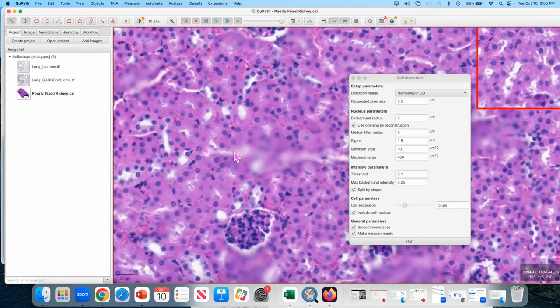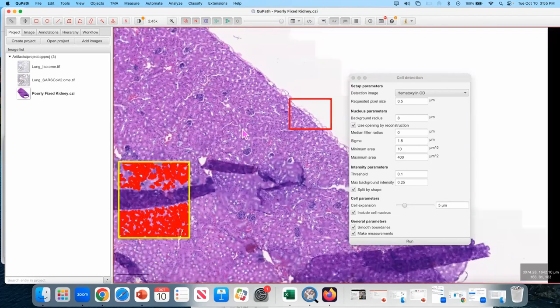There's this thing called Superpixels. This was part of QuPath before the pixel classifier was really built and efficient and working. And so he built it as a kind of pseudo pixel classifier. And I am in love with this feature. It is amazing. I use it pretty frequently. He wants to get rid of it. I won't let him. I keep talking about how amazing this feature is. Sorry, I get excited.